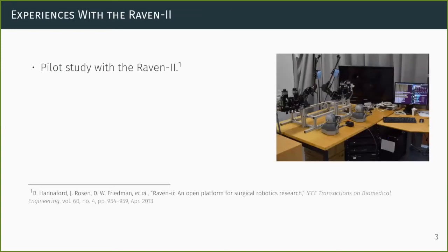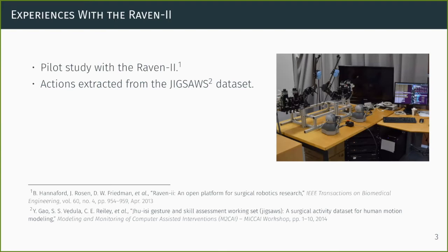And in some of my early experimental work, I used the Raven platform, which we have at SDU, to evaluate my methods. I tried extracting, say, surgical actions from the Jigsaws dataset, as you probably know well, many of you. Even though this didn't contain camera intrinsic parameters or robot and camera calibrations.